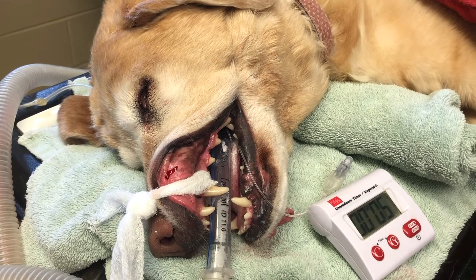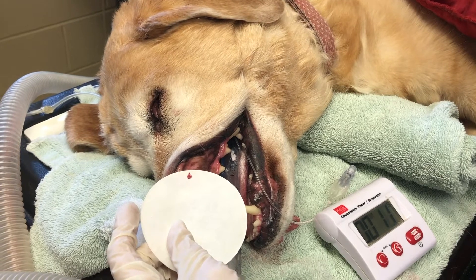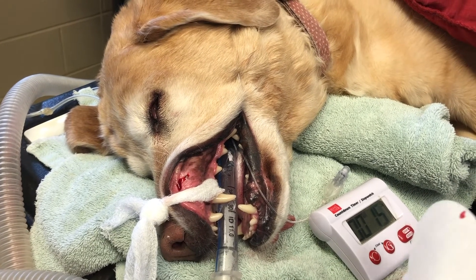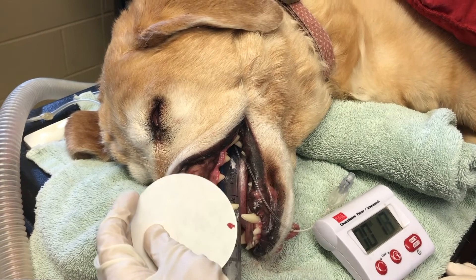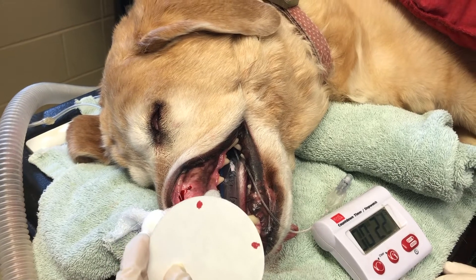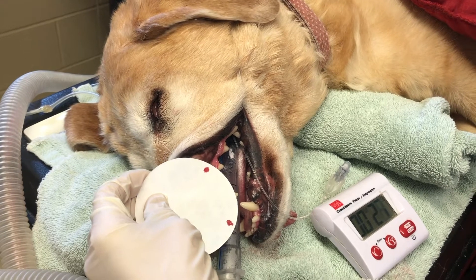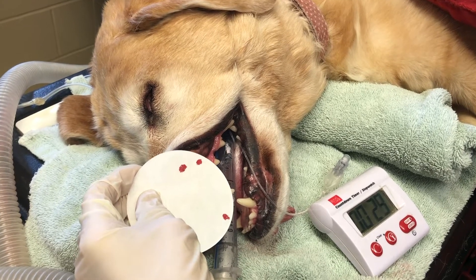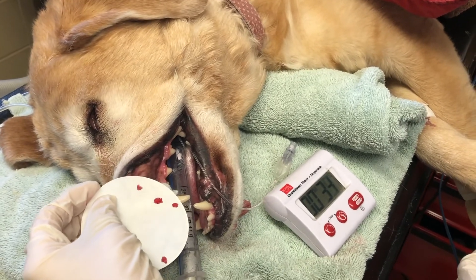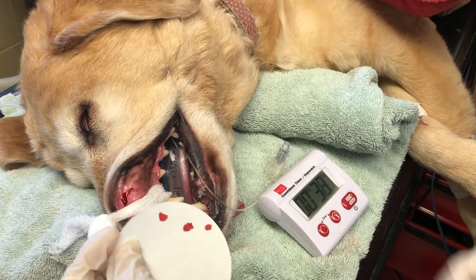I'm going to take my filter paper and just place it near the blood. I'm not actually going to touch it to the incision. We're going to do this every five seconds until the filter paper comes back clean, and that's when clotting has occurred. With most dogs and cats, the normal bleeding time is between one and five minutes, and anything longer than that is considered abnormal and is indicative of platelet dysfunction.